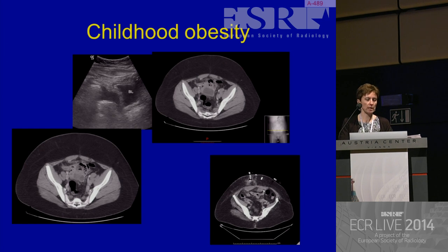We've all come across this. These are two of my recent patients. These three images joined together here are of a 10-year-old boy who weighs 90 kilograms. The first time he came up with vague abdominal pain and raised inflammatory markers, it took 2 radiographers to lift his fat apron to try and attempt to ultrasound him. We could see this little bit of free fluid, but definition other than that was no. And reluctantly, we had to say we were going to CT him.